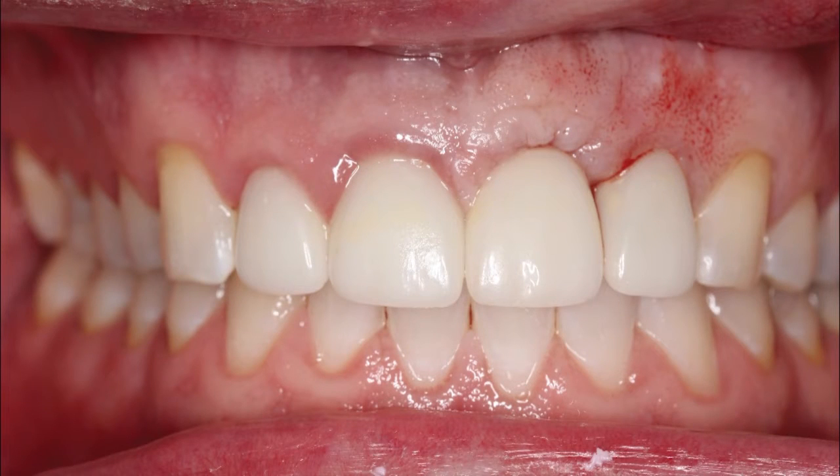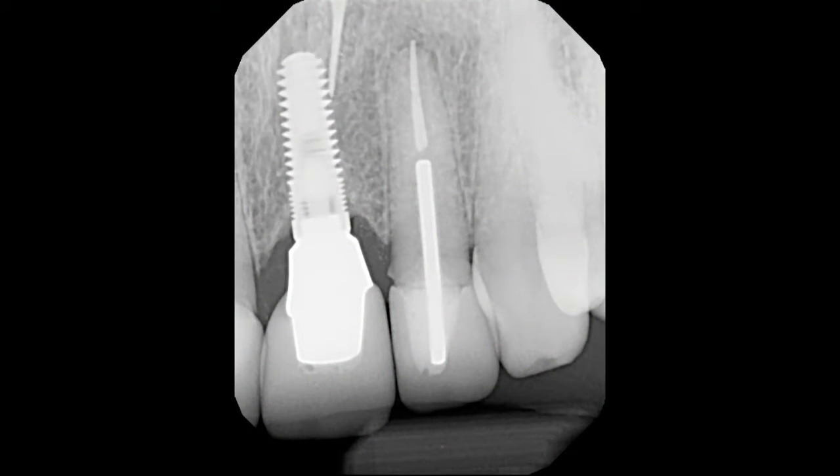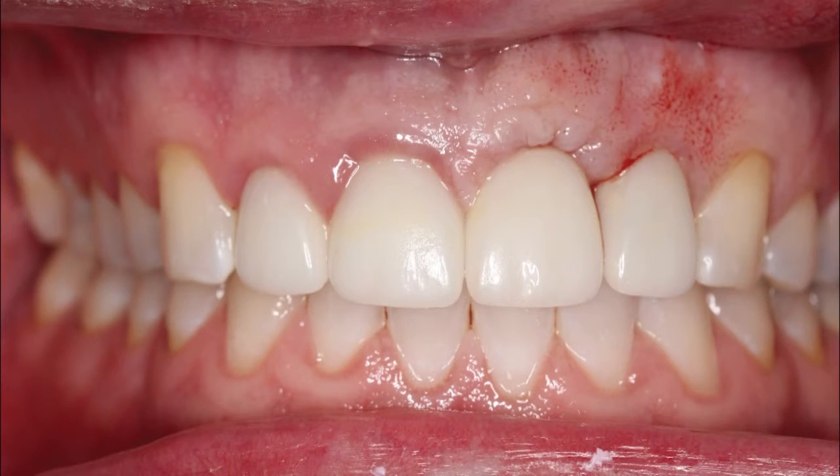A 40-year-old male presented with no medical complications and desired a nice smile for his business interactions. His existing implant crown in the area of his maxillary left central incisor had suffered damage and the adjacent lateral incisor had fractured. The patient's excessive parafunction was likely a contributing factor. Endodontic evaluation had determined that the lateral incisor was untreatable, and the preoperative soft tissue between the central and lateral incisors were not ideal or optimal.